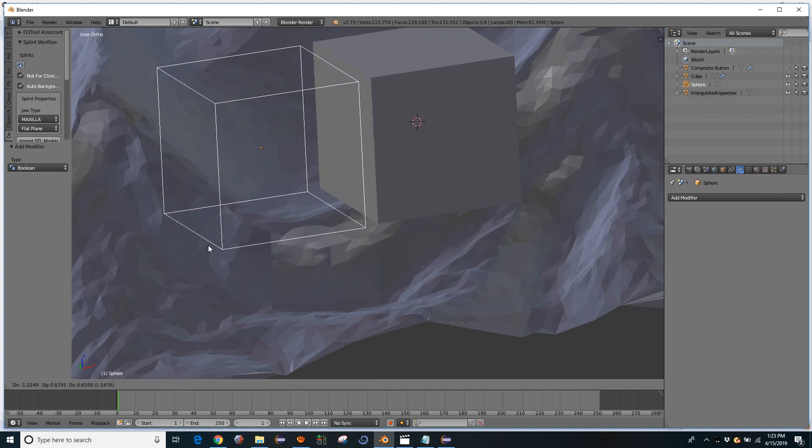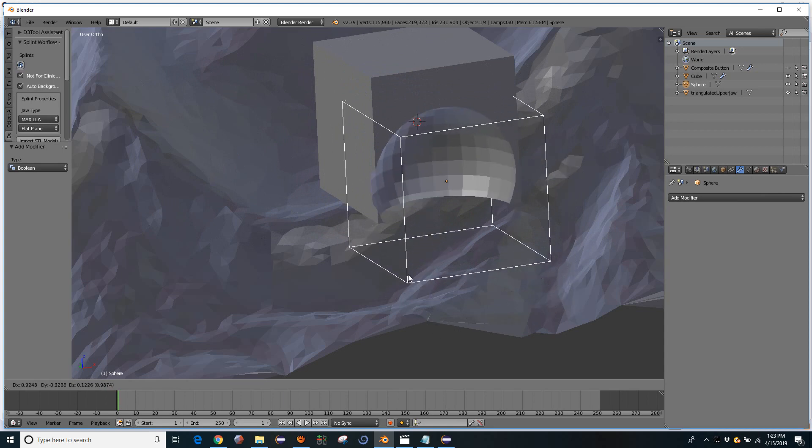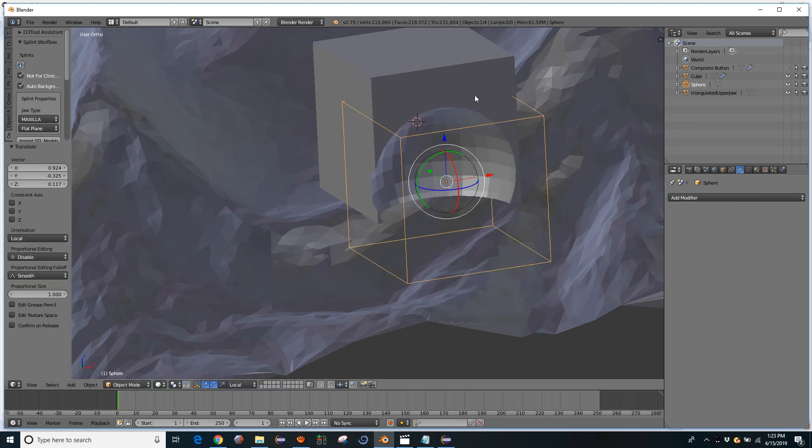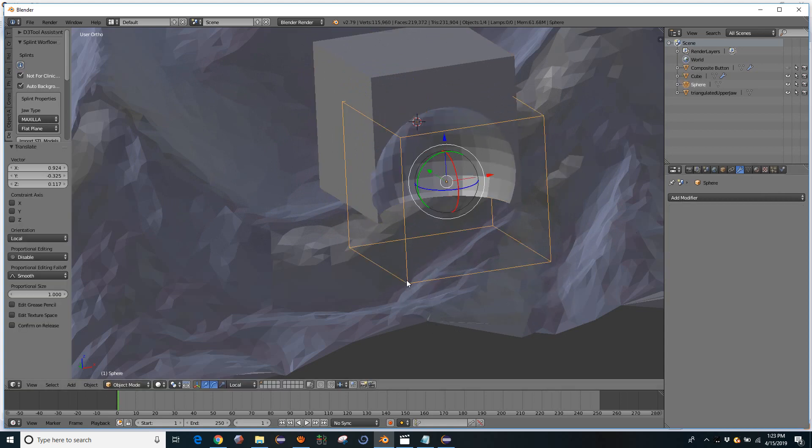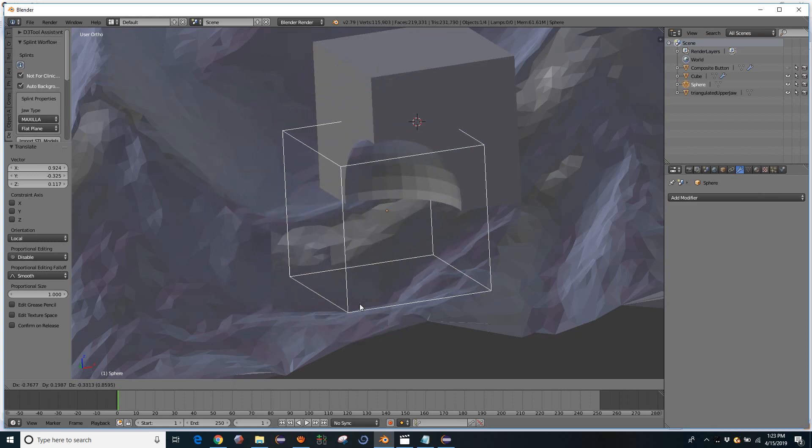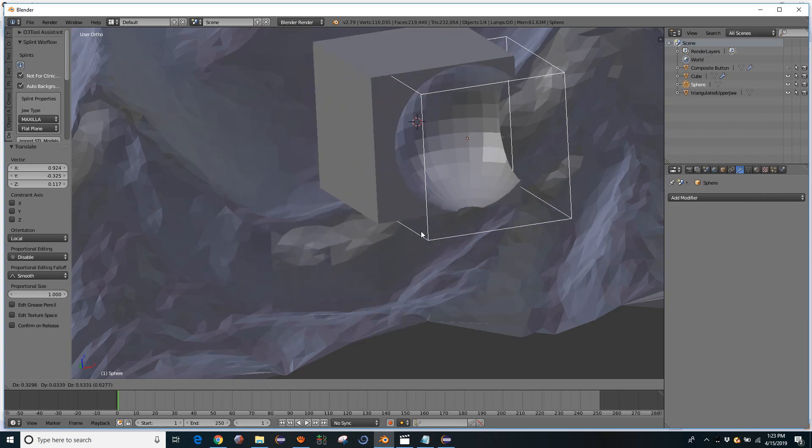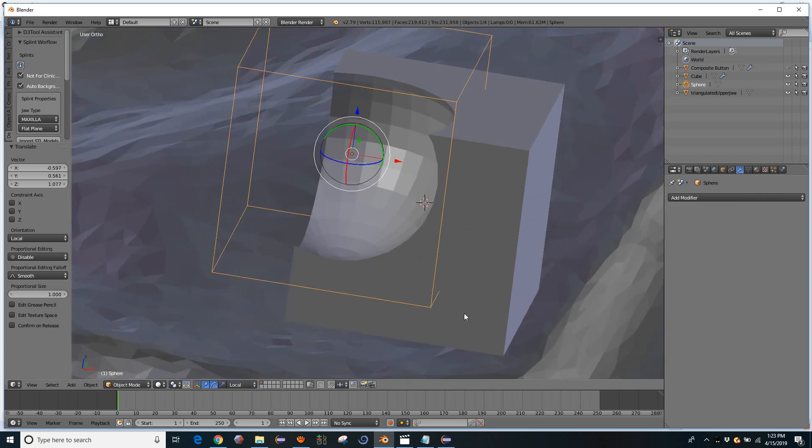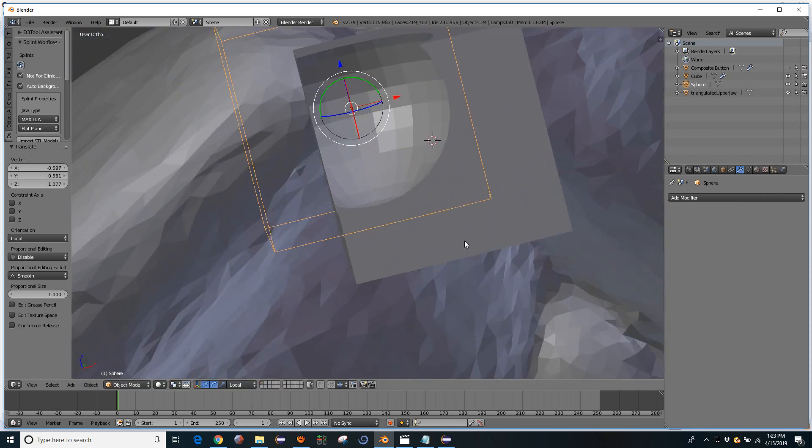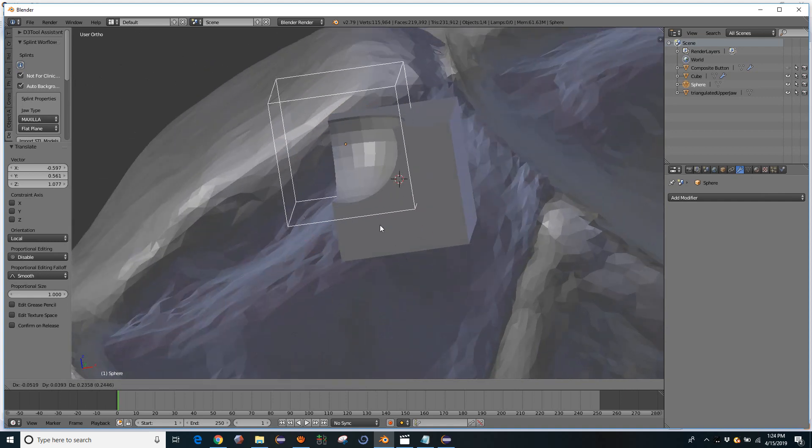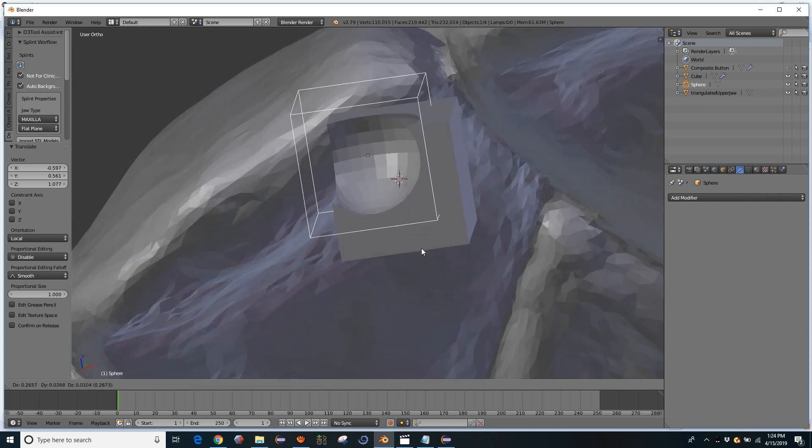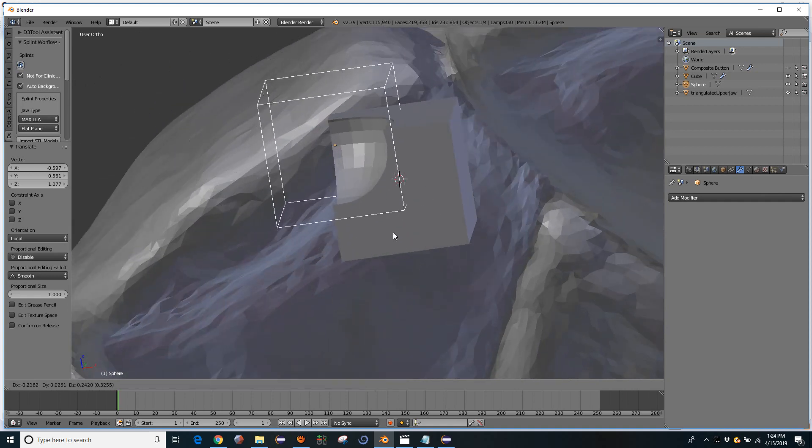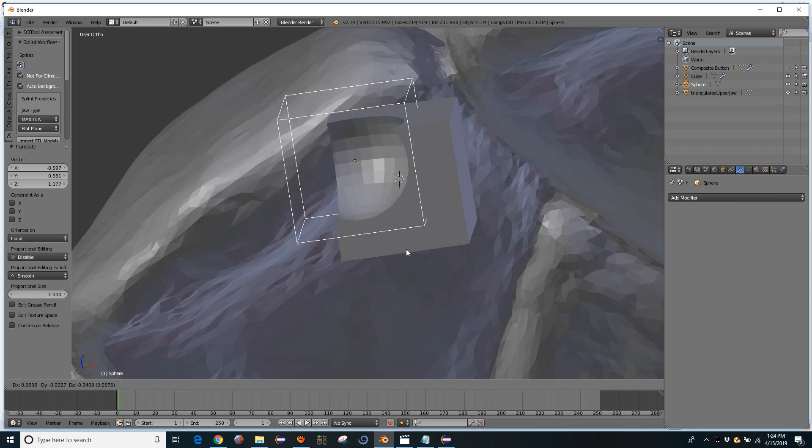And so by keeping the modifier live, meaning it's here, it hasn't been applied, it allows you to have this be more dynamic. So this is fine as long as the objects are simple, and it doesn't take 10 seconds to process that modifier. Like in this case, it's so fast it's happening in real time.